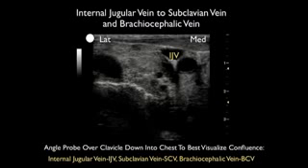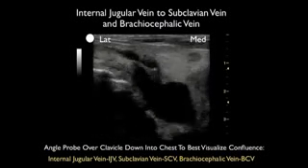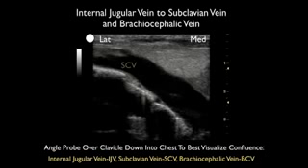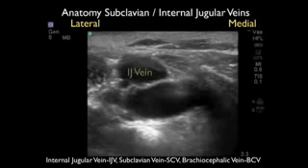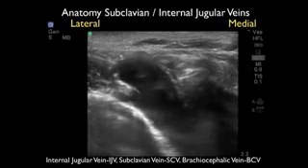Now let's take a look at ultrasound images showing the internal jugular vein running down the neck and joining with the subclavian vein at the brachiocephalic confluence. We can see the subclavian vein arching from the lateral aspect to the left of the image and joining with the brachiocephalic vein medially. We'll be aiming the needle for that confluence. The structure is relatively superficial — depth markers show the subclavian vein is at about one centimeter depth. We then tilt the probe slightly anteriorly to pick up the subclavian vein running into the brachiocephalic vein.